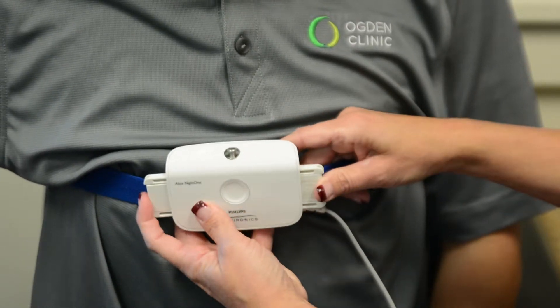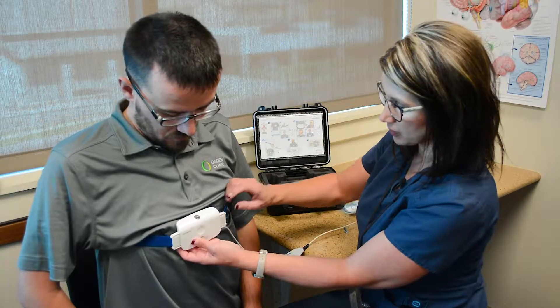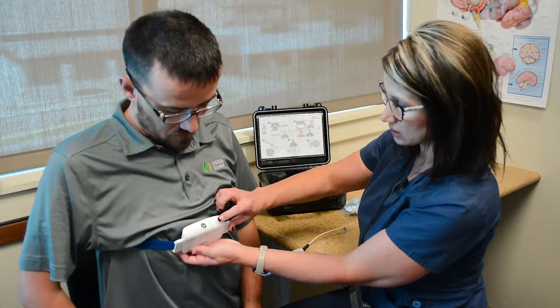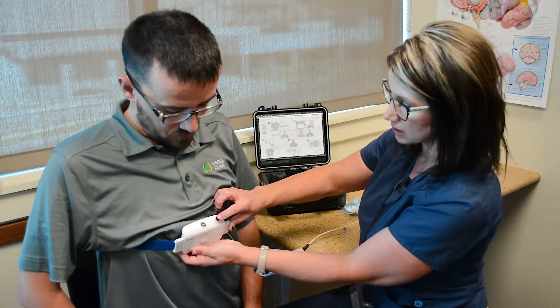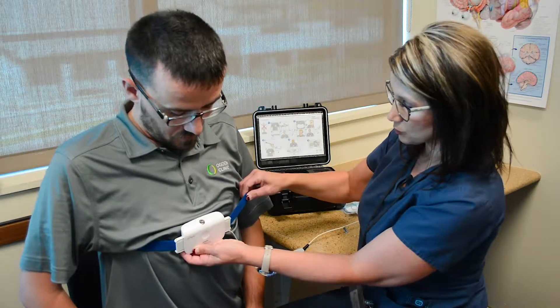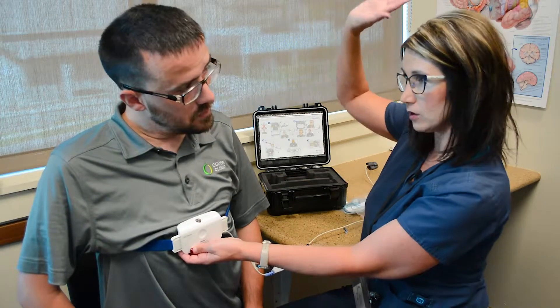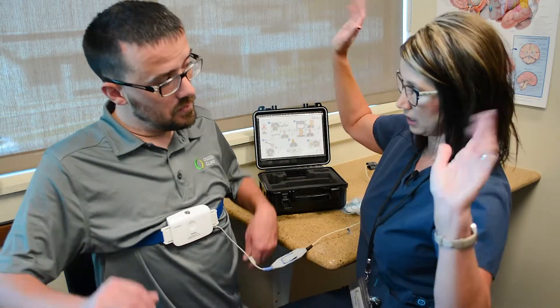It just says that it's on and it's reading. It does take a couple of minutes to acquire the signals for each one. The first signal we're going to be looking for is a little indicator — it's going to appear up here at the top. It's going to be yellow at first, and then it'll turn green. You don't want the belt so tight you can't breathe, but you need it snug enough that if you lift your arms up, it's going to stay in place.